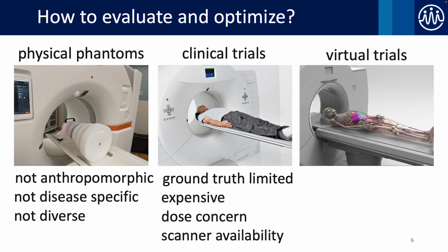But that all brings us to the reason and rationale of why we do virtual trials. Because with virtual trials, which is, can we mimic the clinical trials in a virtual space? You would have access to ground truth. You know what you're modeling. It would be cheaper. You're working with simulations and computers, not multi-million-dollar scanners. These are virtual patients, so you do not need to be worried about those concerns or imaging them multiple times.